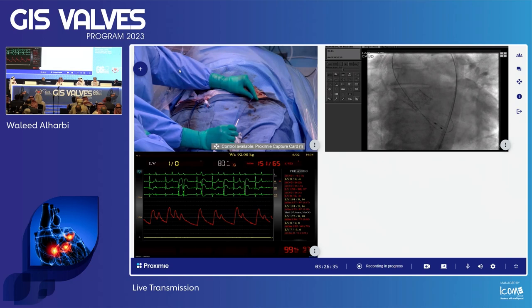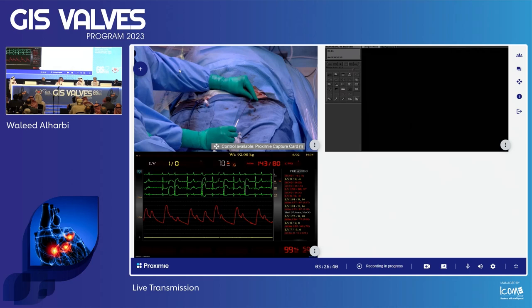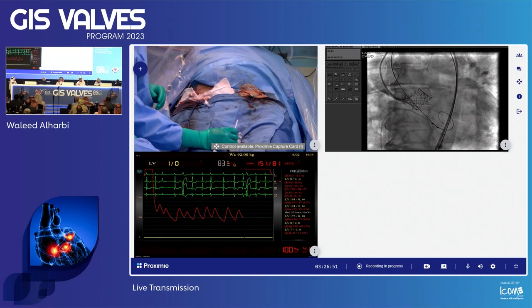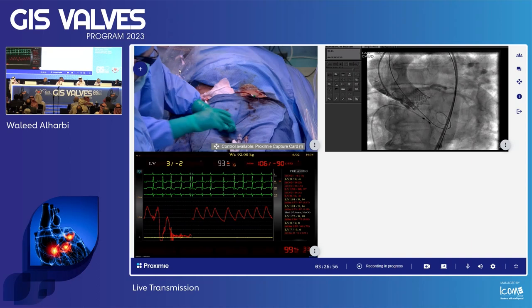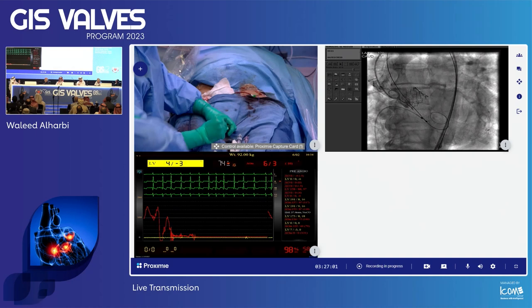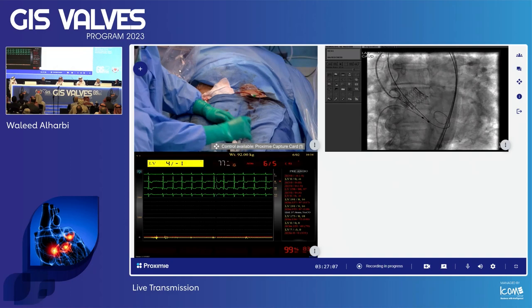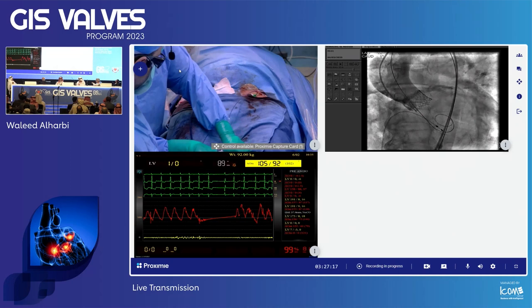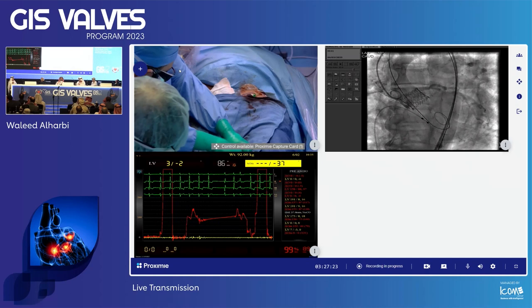Fair enough — good point. Ready for the aortogram. The position looks good, and you can see there is no paravalvular leak on the aortogram. The coronaries are filling. Are you going to check the hemodynamics as well? Given the earlier comment about using a self-expandable valve, it's very important to look at the gradient at baseline post-TAVI.